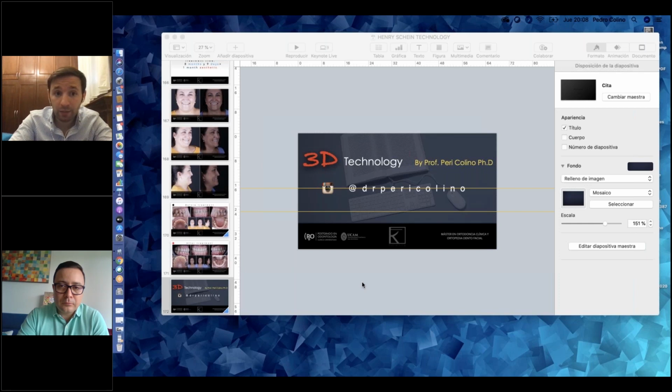In class 3 patient, force 1 from the beginning until I reach the class 1 platform, okay? I never use force 2 in class 3 patient because I can solve it in a predictable way with the first force, with the force 1. And it's really important to use 3 times a day the elastic, 3 different elastics a day.